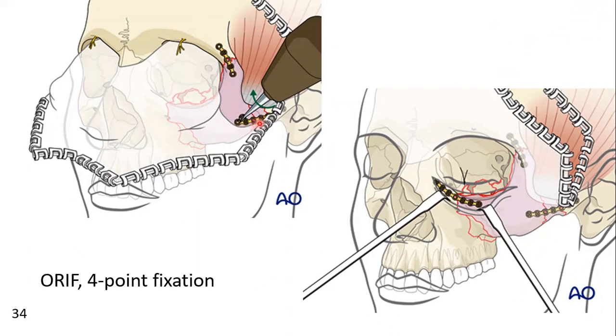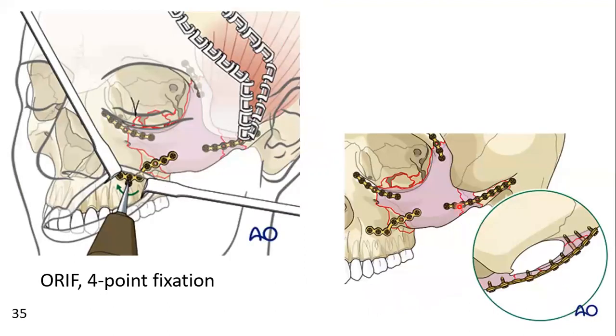Prior to placing this plate, a minimum of 2 screws should be placed on each side of the fracture, as we have explained. That is the general principle. Prior to securing this plate, make sure that the reference points of the lateral orbital wall, infraorbital rim, and the lateral maxillary buttress area are properly reduced. Here you can see that all areas should be properly reduced.